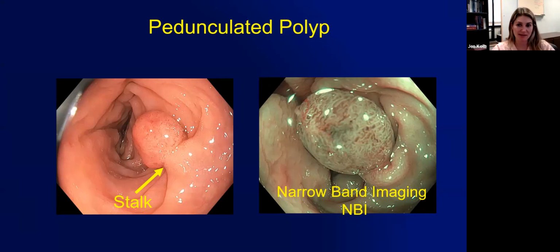was examined under NBI. And it's interesting, as you may see, how it goes from this typical pinkish, whitish mucosal appearance. When you use narrowband imaging, it's a red, blue, green light filter, and so it just changes it. So you can really appreciate the vascular pattern, these capillaries here, because they really jump out at you.